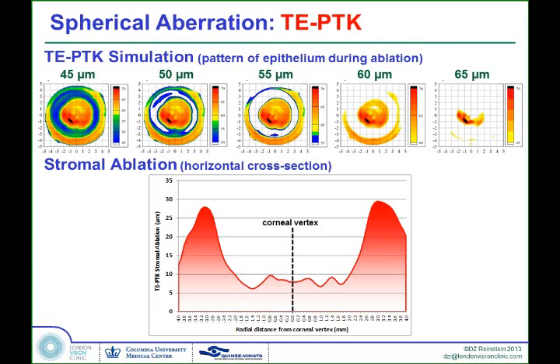If you were to simulate, using for example here an Artemis epithelial scan, and remove consecutively epithelium from the surface further down deeper into the cornea, what you'll notice is, for example, in this 50 micron ablation pattern, you start to selectively, in white, remove stromal tissue from the periphery. The epithelium, which is thickened after the myopic ablation in the center, acts as a mask, so you don't remove stroma in that area.